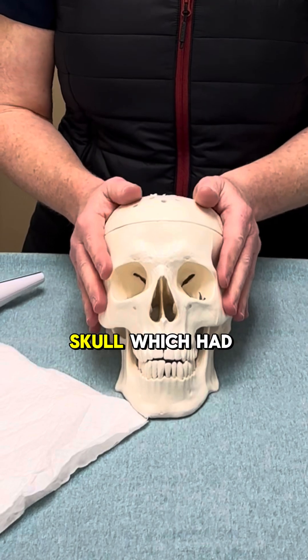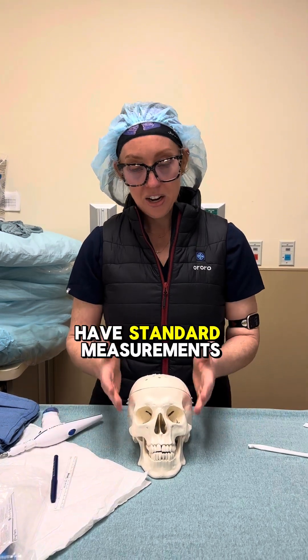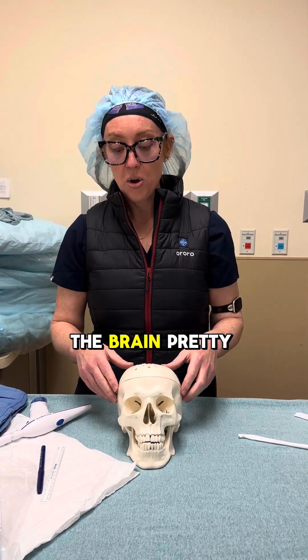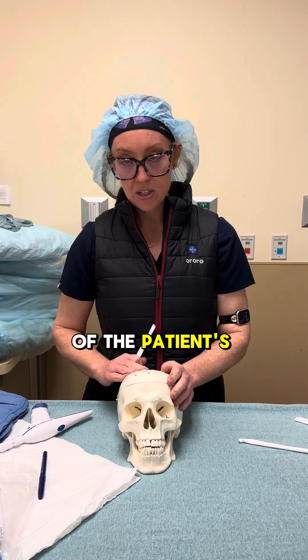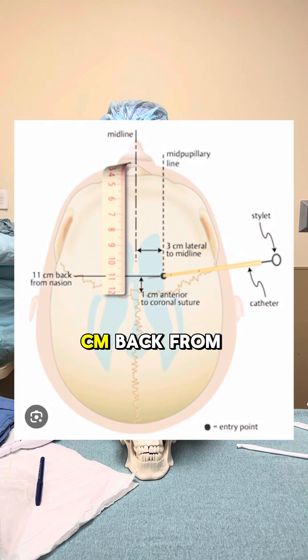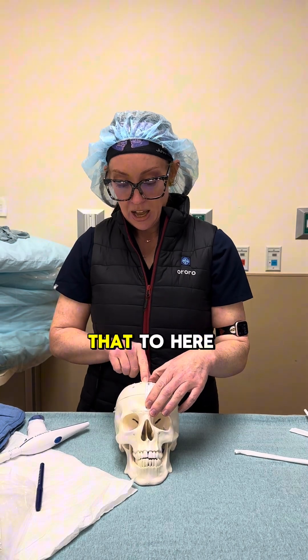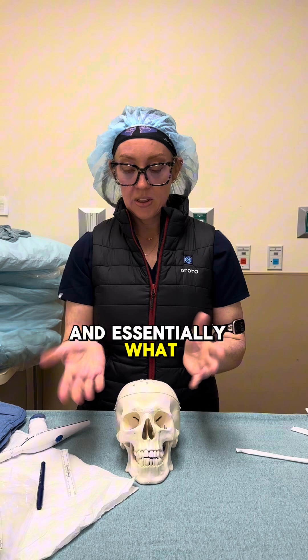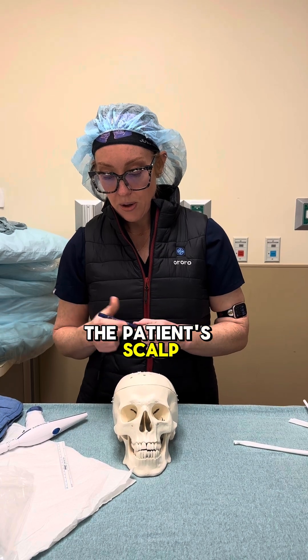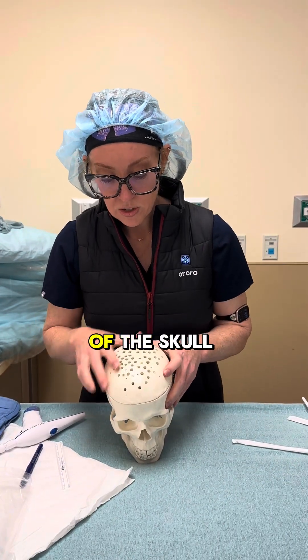This is a skull — it's had many of these little holes done, whereas normally someone's skull does not look like this. We use standard measurements to access the patient's ventricle, the fluid-filled space of the brain. We typically shave an area of the patient's hair, then measure to a point called Kocher's point — 10 centimeters back from the nasion, which is the center point between the patient's eyes, and then two and a half centimeters over. That gives us a safe entry spot into the brain, typically landing on the coronal suture, one of the skull plates.